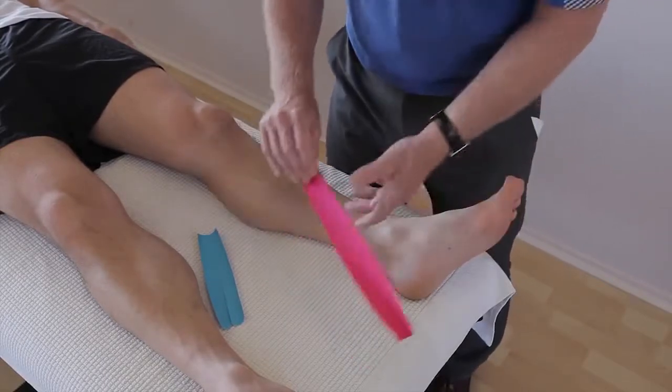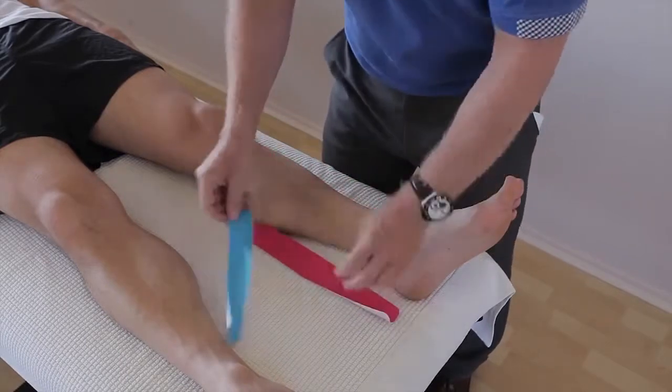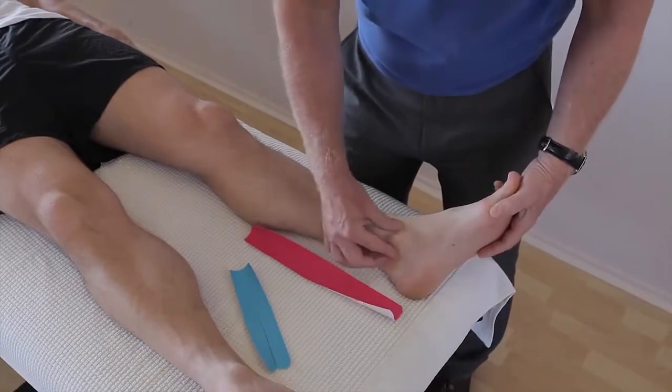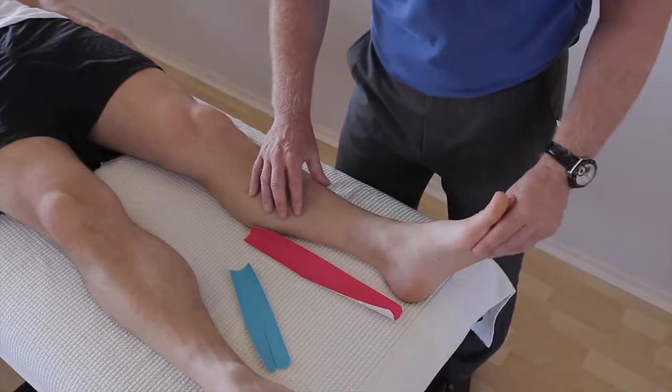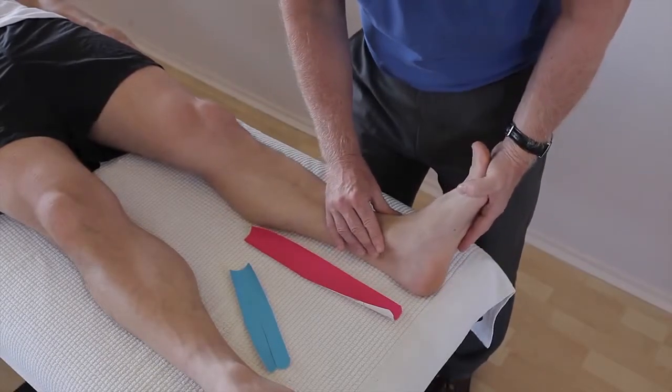So the two bits of tape are prepared. The first one is a standard I strip, and the second one is an I strip cut into the shape of a Y. Tibialis posterior goes to the navicular, and it's responsible for plantar flexion and inversion. So we're going to bring the foot up into dorsiflexion and evert to stretch it.